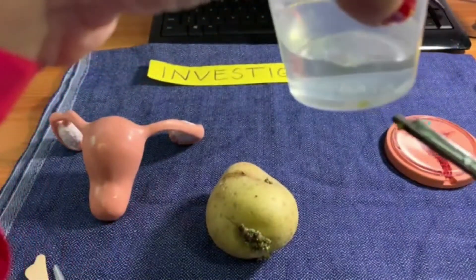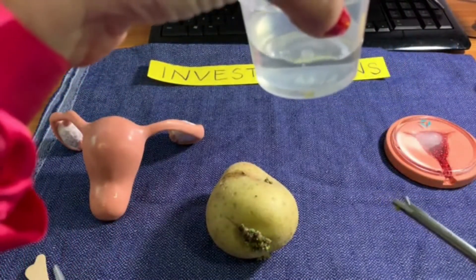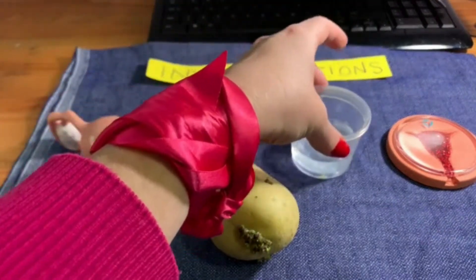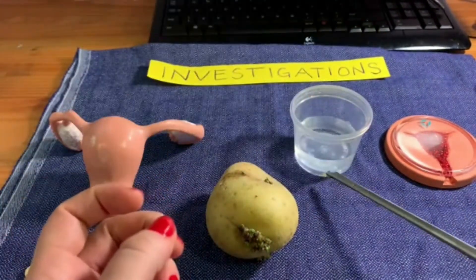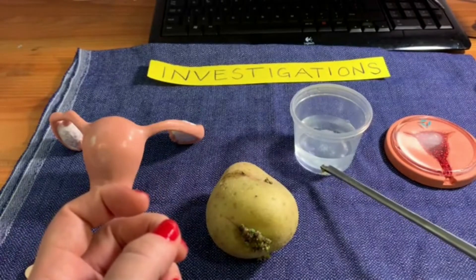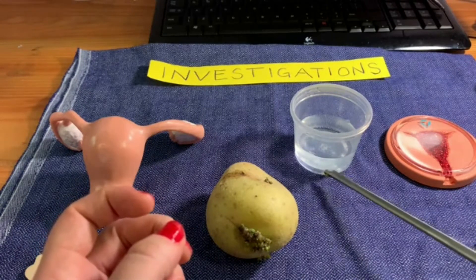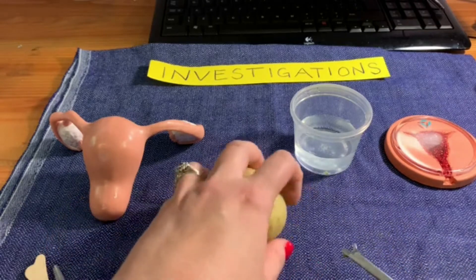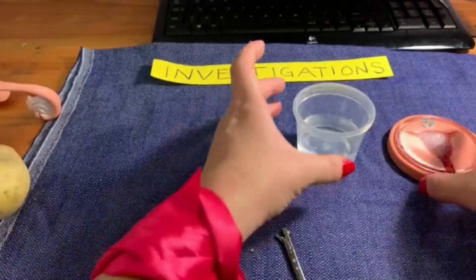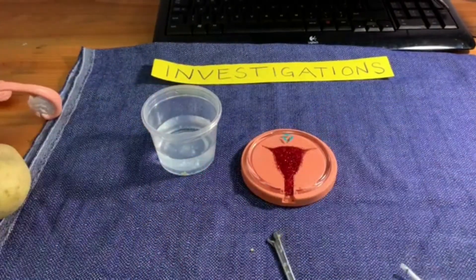That small piece is all the lab really needs — the histologist will fix it, slice it up, and examine it. This is the formalin the specimen would go into. So those are the cervical investigations.